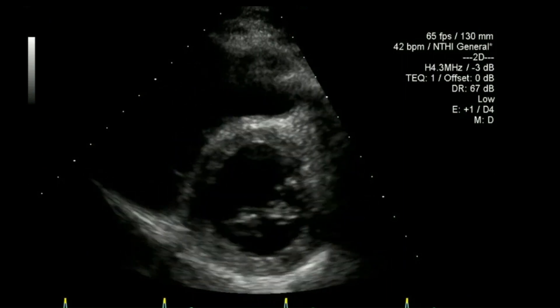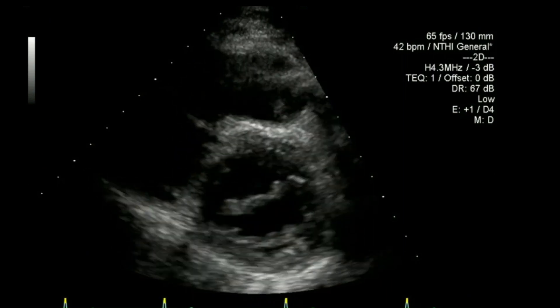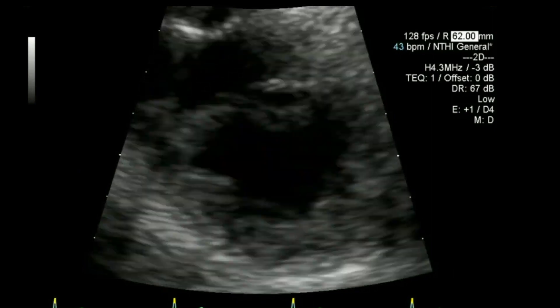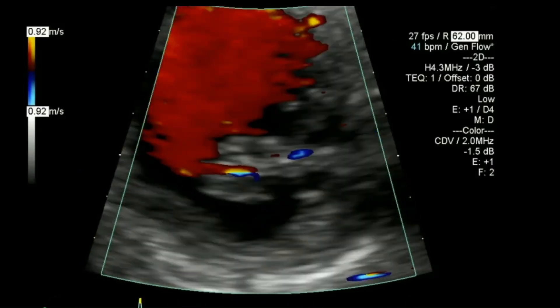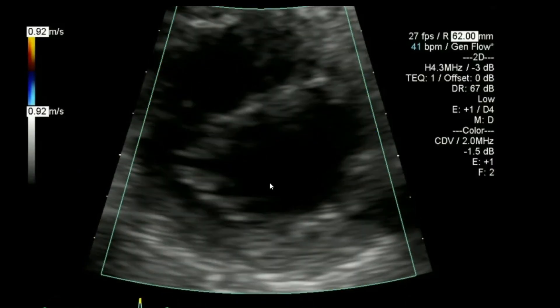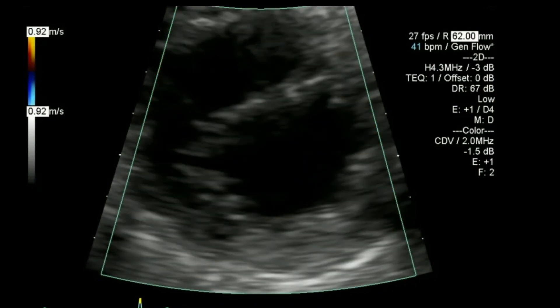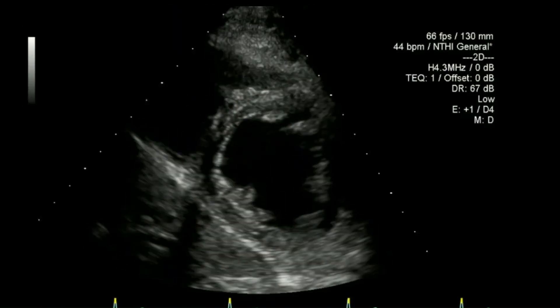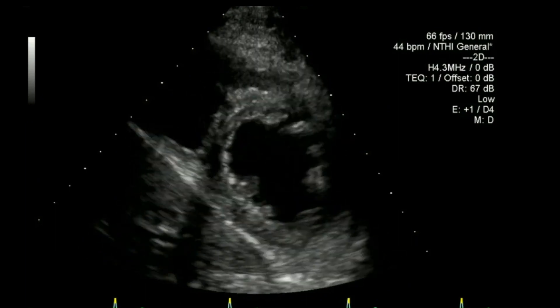Next I'll go to the mitral valve level in short axis, then zoom up on the mitral valve and put the colour flow on so I can see the point of origin of any leakage there.